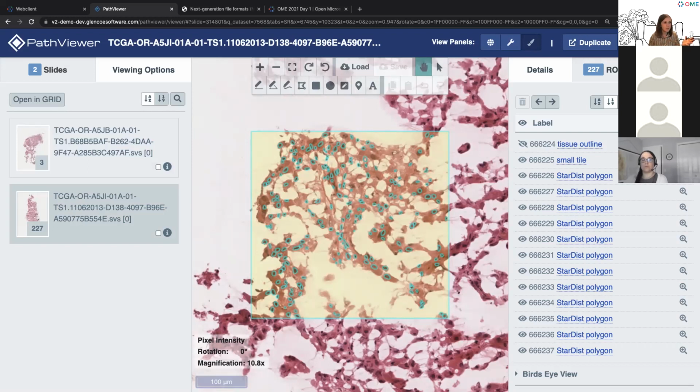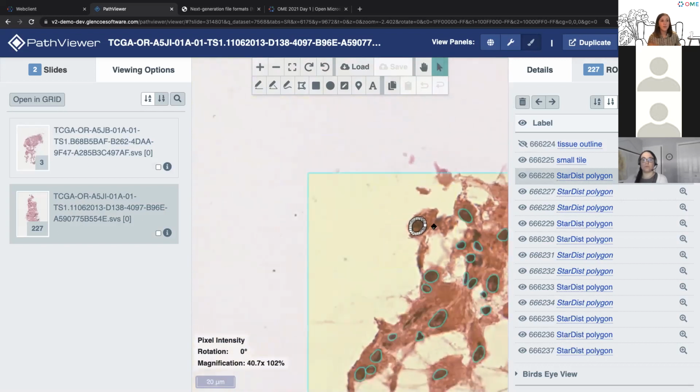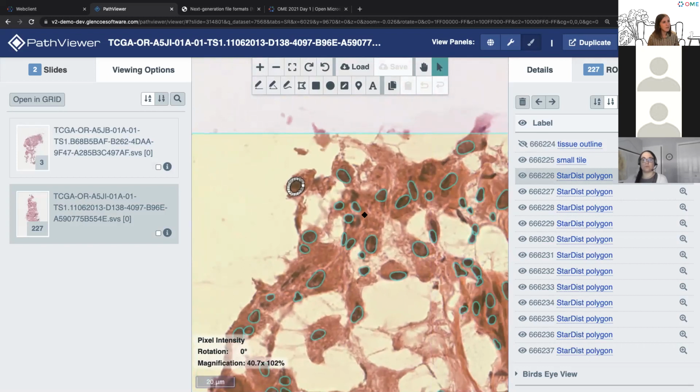Okay. So StarDist was used to find all of these nuclei, and essentially each of these entries in this list here is one of those polygons. Each of these polygons is represented by 32 coordinate points, and this is a perfectly fine way to represent this nuclear segmentation. I can clearly see each individual object here, and I can even interrogate each one specifically.